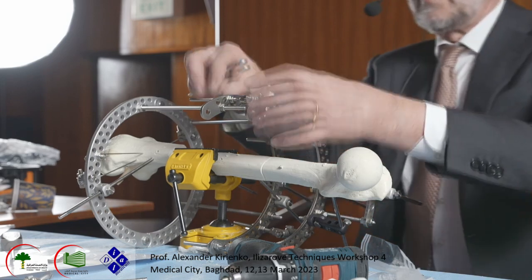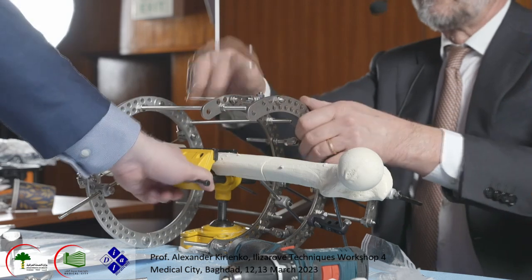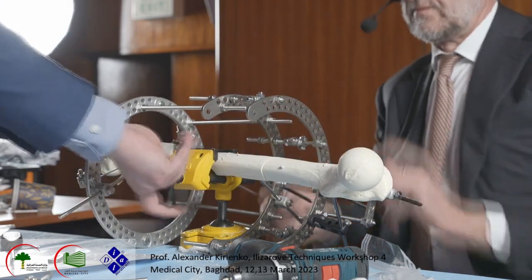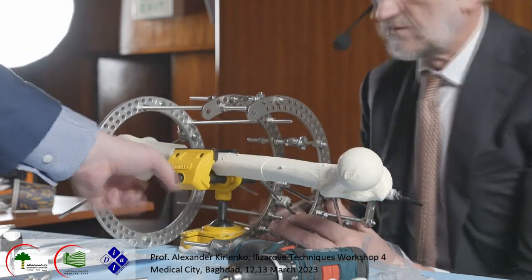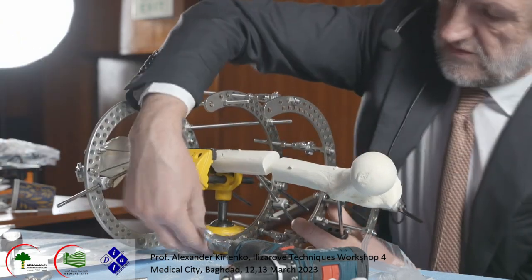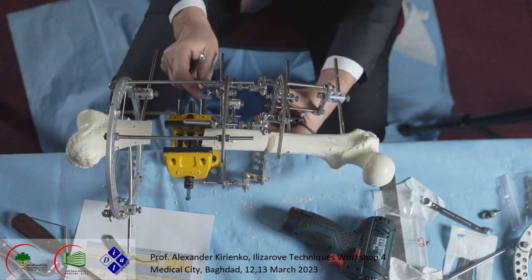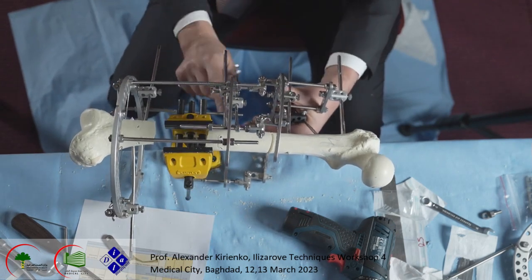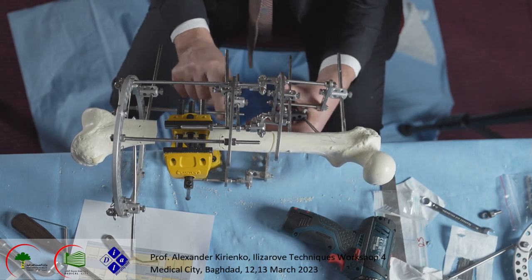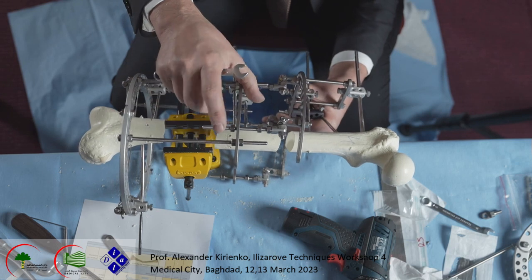In the proximal part, we do lengthening. Lengthening of these 4 rods simultaneously, slowly, 1 millimeter a day. And we achieve this lengthening like this.